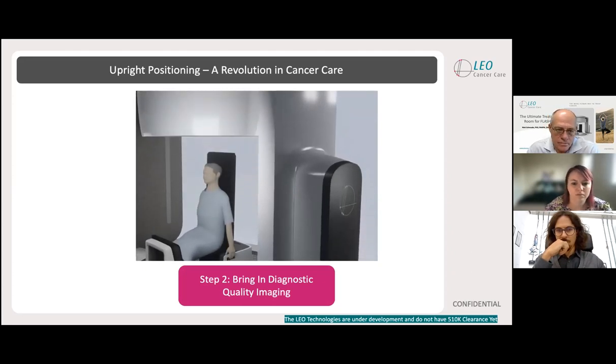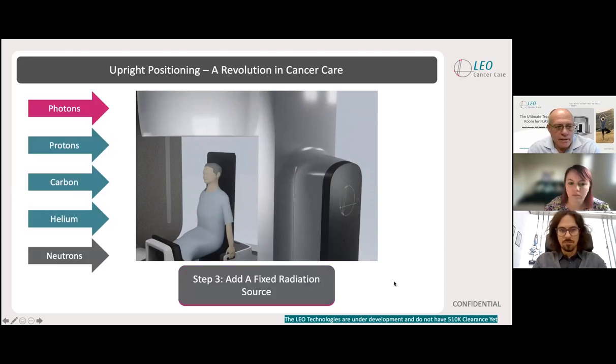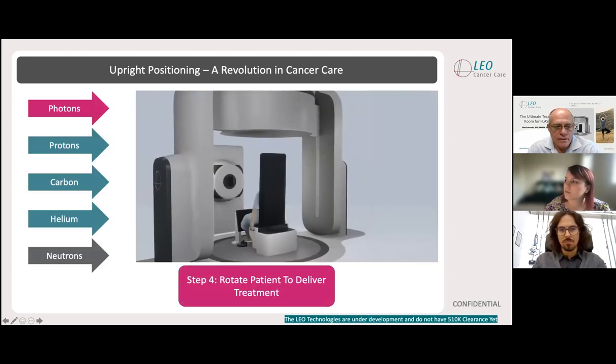The scanner ring is 100% balanced. It takes about a 10-pound force to push the scanner up in case a power failure would occur. And then we can put this device in front of any treatment beam.